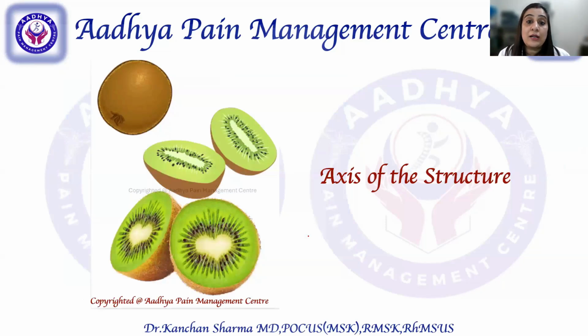But when it comes to ultrasound, remember it with this kiwi diagram, so it will be easy for you to remember. Those who are new, please use this analogy to understand the longitudinal or the sagittal axis, or the axial or the short axis. So if I am going to divide this kiwi into two halves, that is your longitudinal axis or the sagittal section.